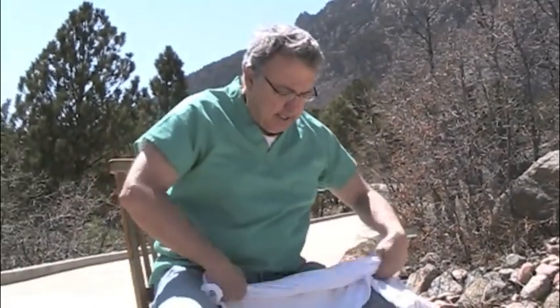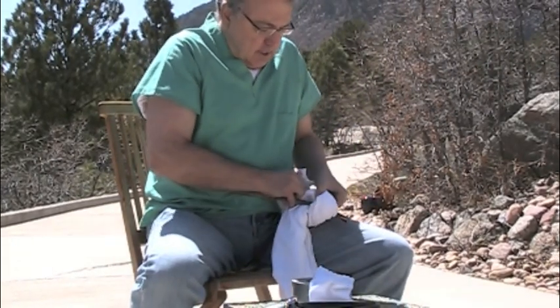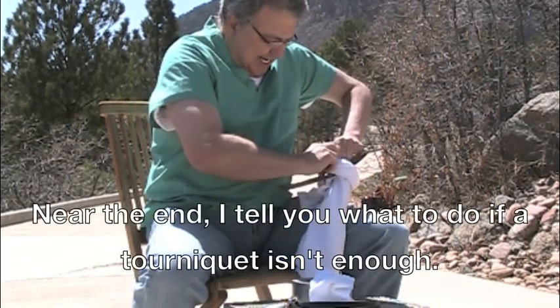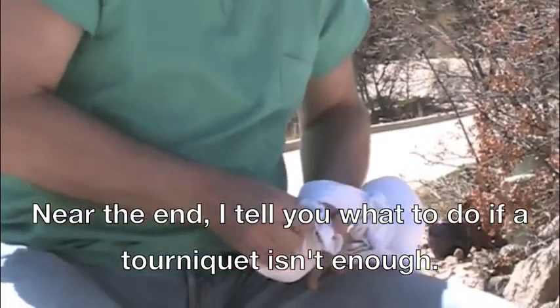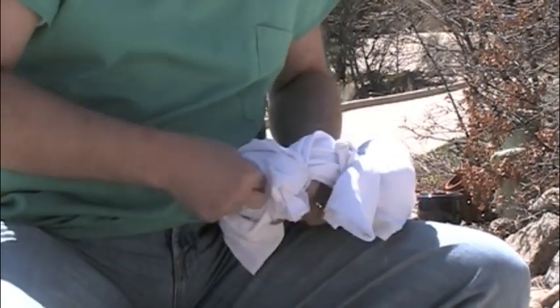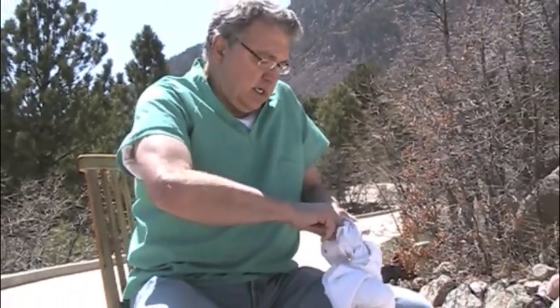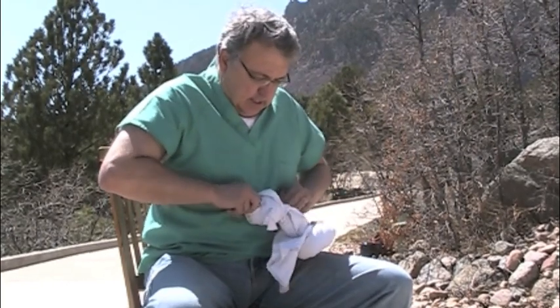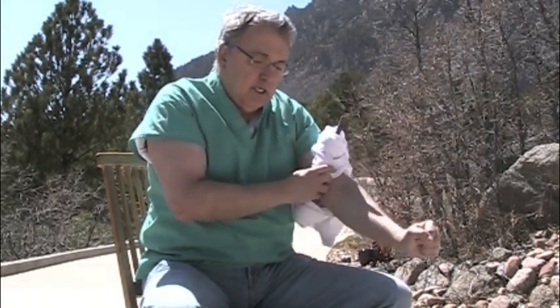For a t-shirt or any shirt, I would rather it be ripped in half, so it's not quite as thick as this, but we'll try just a regular old t-shirt. Wrap it up, tie it on each end. Again, it's a little thick to try to do that on, but it's possible. Twist, and you twist it until the bleeding stops, and keep it in that place.